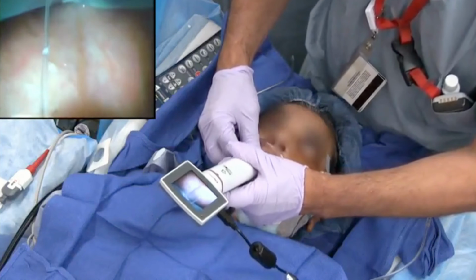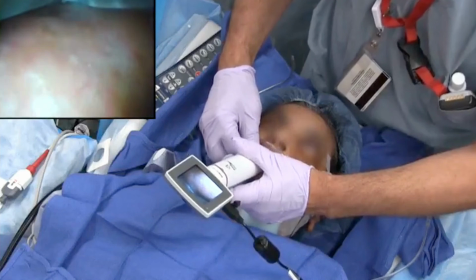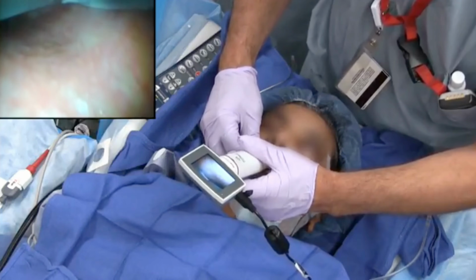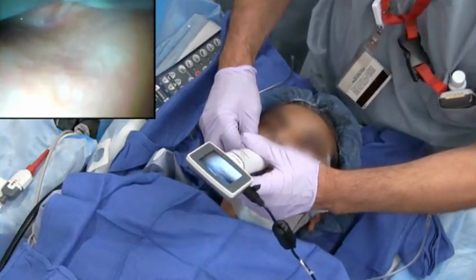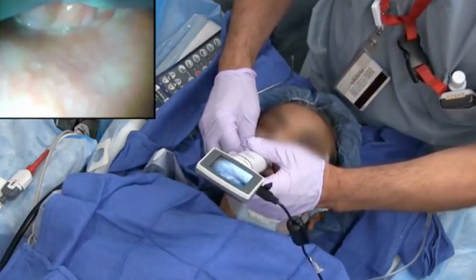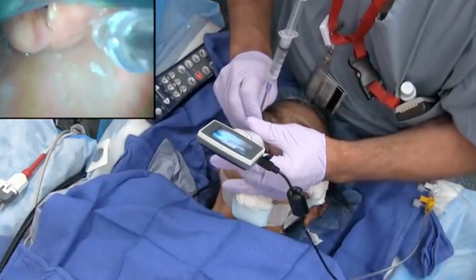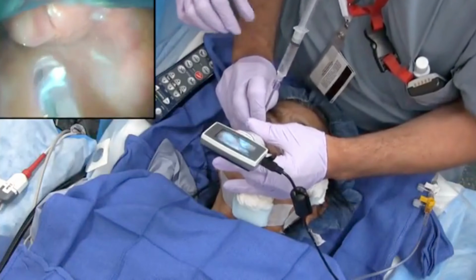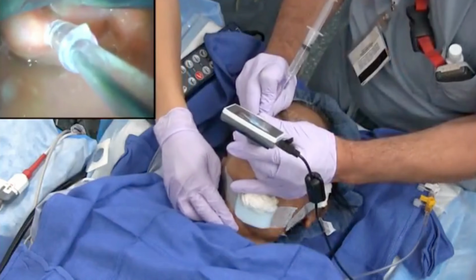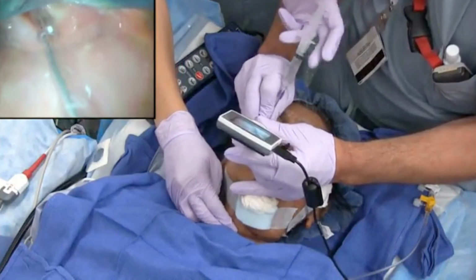Hold the video laryngoscope in your left hand. Insert the blade gently in the midline of the mouth. There is less need to aggressively sweep the tongue. Advance slowly while watching the screen. As the blade moves forward, identify familiar landmarks. First the tongue, then the epiglottis, then the vocal cords appearing on the monitor. Once the cords are clearly visible on the screen, stop advancing the blade. More depth rarely improves the view.